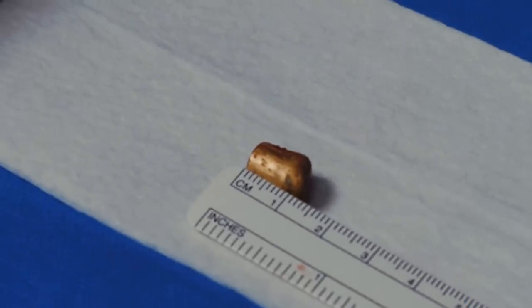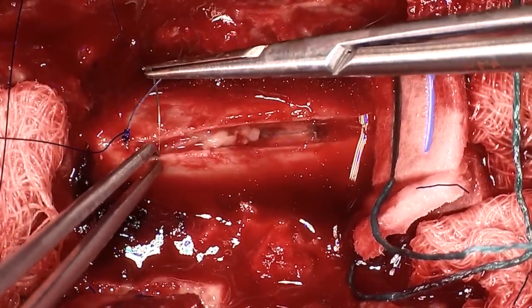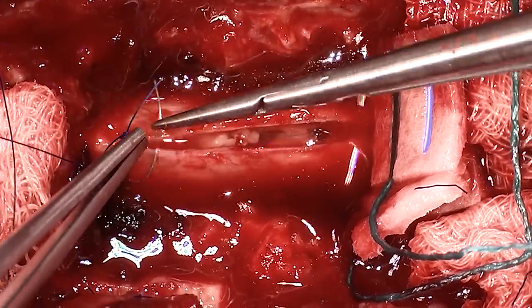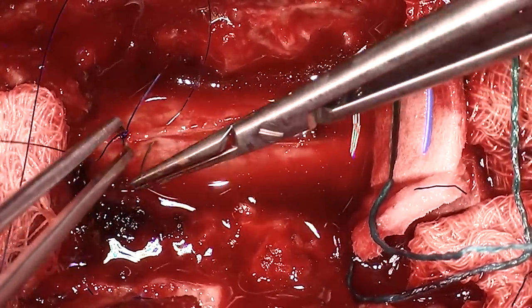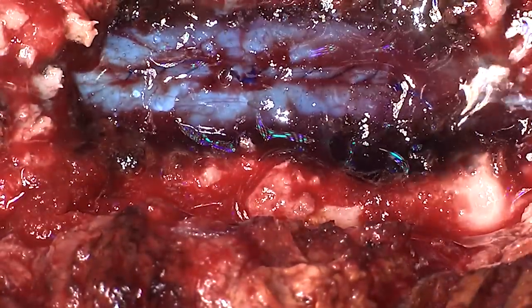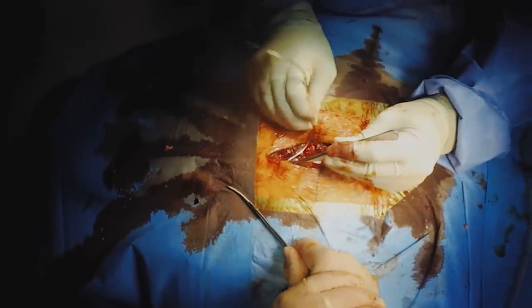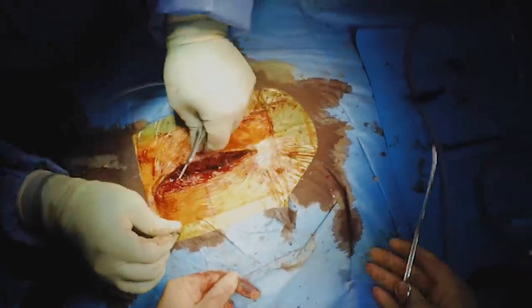So after that very satisfying bullet removal, we still need to close up what we've done. The dural edges need to be closed together because apart from the spinal cord lying in there, there's also CSF or cerebrospinal fluid. If this keeps leaking out through a defect that we've made, it can cause the wounds to not heal properly. On top of this closure, we put something called Duraceal and this is an artificial glue that helps seal everything off. The next thing to do is we tunnel a drain in to let any excess blood out because we don't want that to compress the spinal cord.